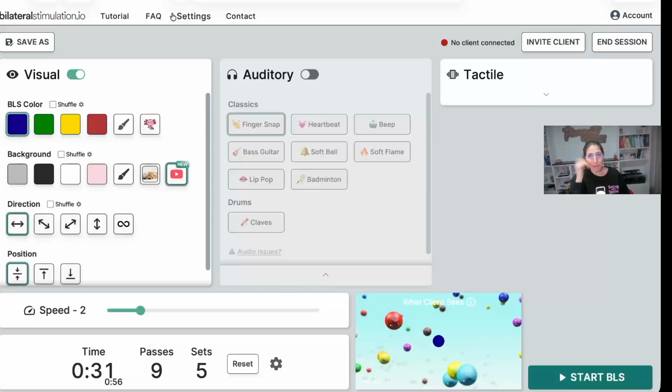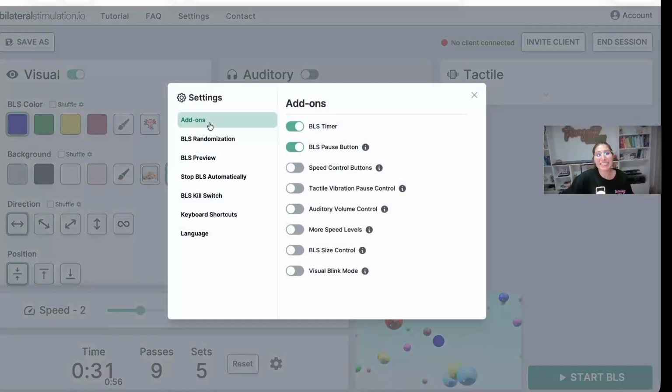But let me show you something even cooler, which sold this product for me. It is the settings, okay? I didn't even know about this until, I'm embarrassed to say, quite long, until after I had already paid for this and had been using this, just because I didn't look at the top of my screen to use settings for whatever reason. We've got everything.